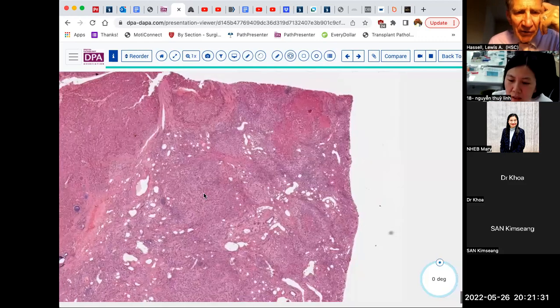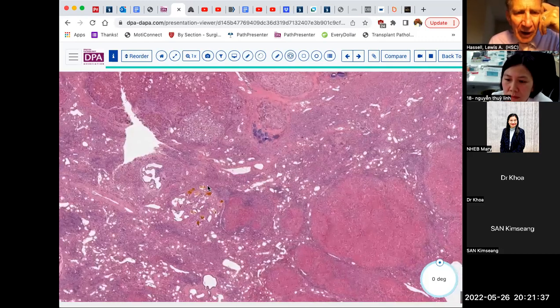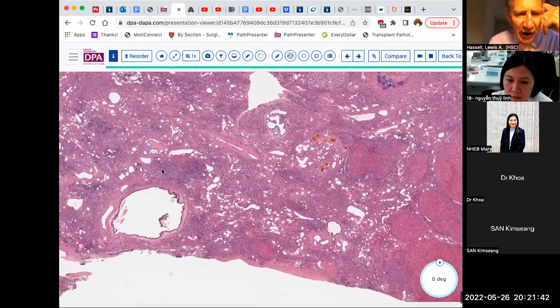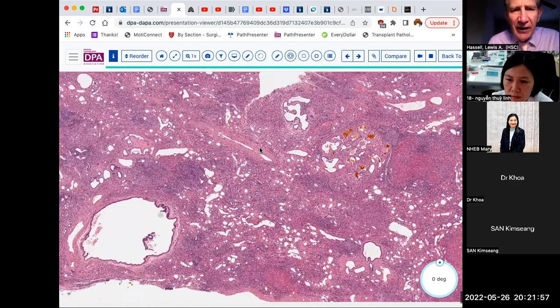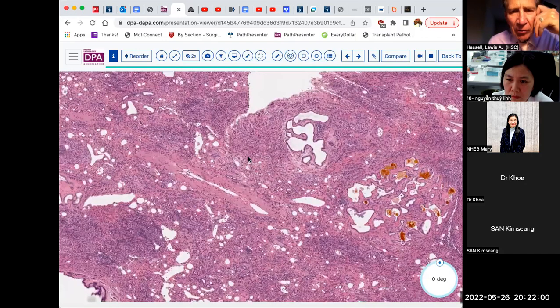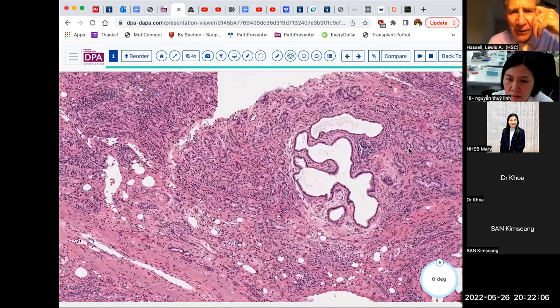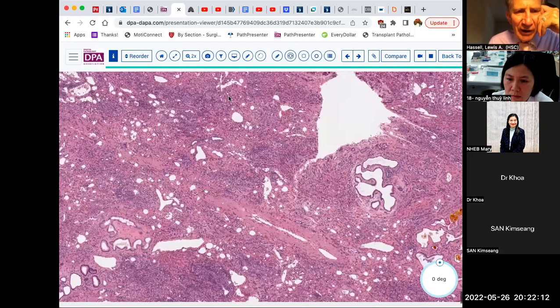And so you want to be careful that you don't mistake this proliferation for a combined hepatocellular and cholangiocarcinoma. So seeing residual large ducts as well as intervening structures here, this is an indication that you had a normal hepatic lobular structure that has regressed, and it's been supplanted by a bile ductular proliferation as these bile ducts looked further and further to find hepatocytes that could feed them bile, but they didn't find them. So they're just left proliferating in this nodular fashion.